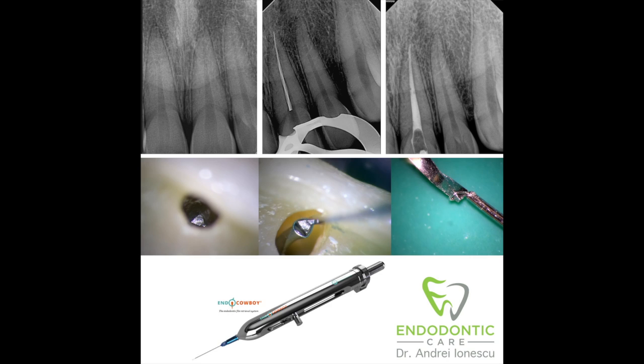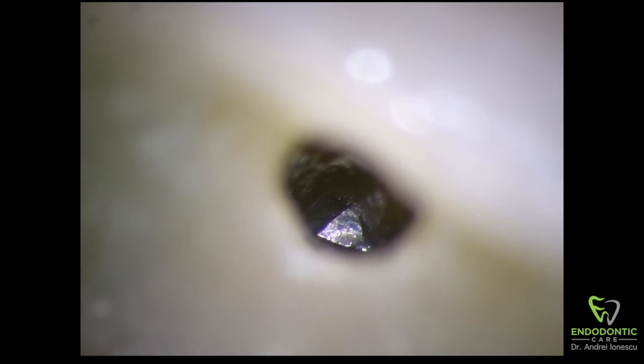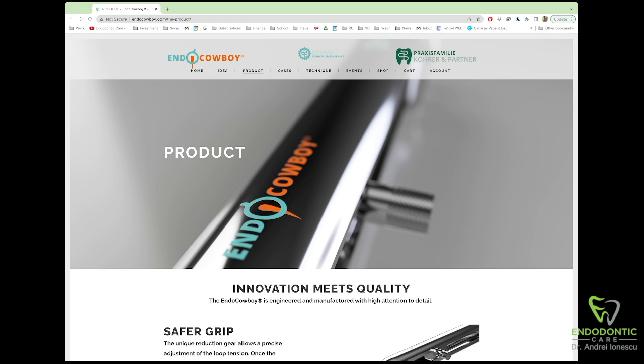This tooth is actually very long — 32 millimeters in length — and a large piece of instrument broke to the level of the CEJ. The crown of this tooth is very large, so even though you can see the instrument through the microscope, it's about 15 millimeters down from the incisal edge. The EndoCowboy was a good tool here to grab hold of this instrument and pull it out.